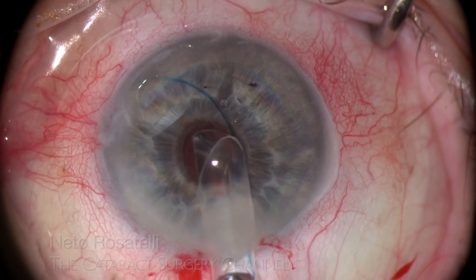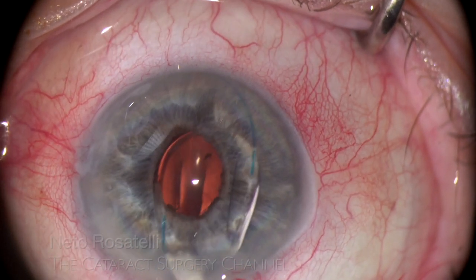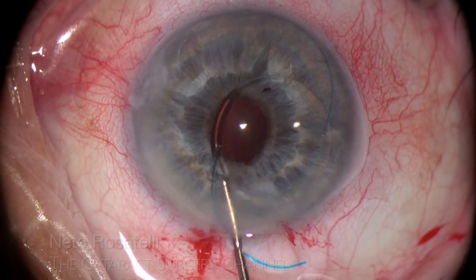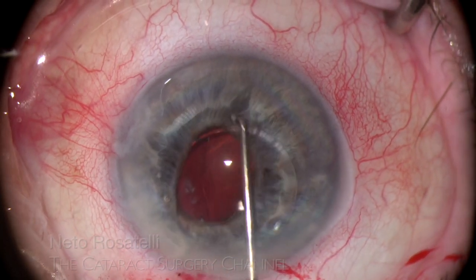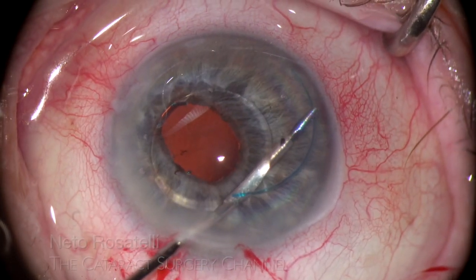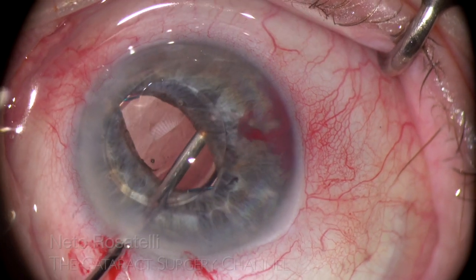The ideal IOL for this technique is a three-piece hydrophobic acrylic one and an AR-40 is chosen. Now carefully injection is performed to place the IOL's leading haptic over the iris in the anterior chamber. The trailing haptic is maneuvered through the pupil sliding along the posterior iris face to safely land in the sulcus without damaging the anterior hyaloid — no space for errors here. I then using the B-hex micro forceps ensure the second haptic positioning in the sulcus, maintaining the optic captured by the pupil. The haptic was entrapped in a few iris fibers and a small bleeding occurs, but the IOL is perfectly placed for fixation now.